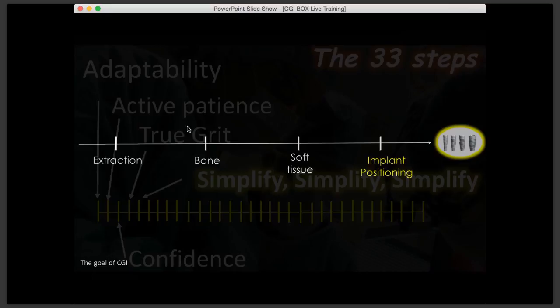Okay. Now, a lot of doctors ask me, part of this course, sorry, with DICOM, what do I need to know about DICOM? Well, you don't need to know anything. You need to know that the CT scan is basically made out of multiple files, and multiple files called DICOM.